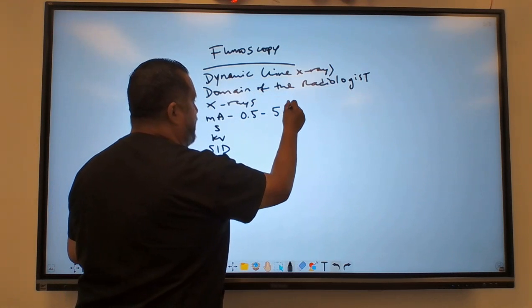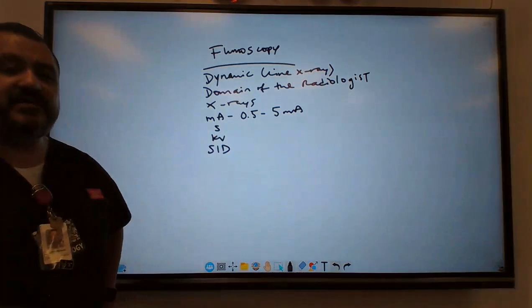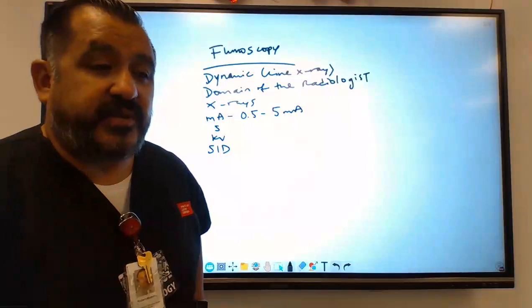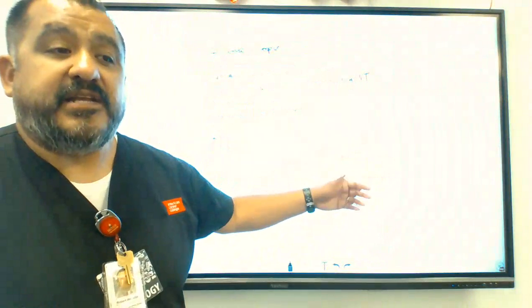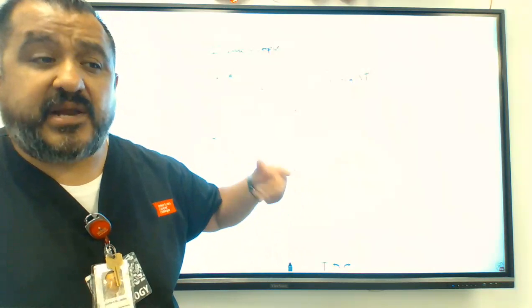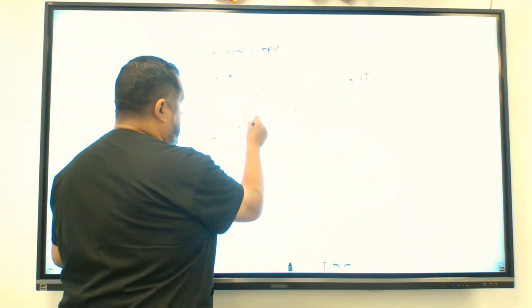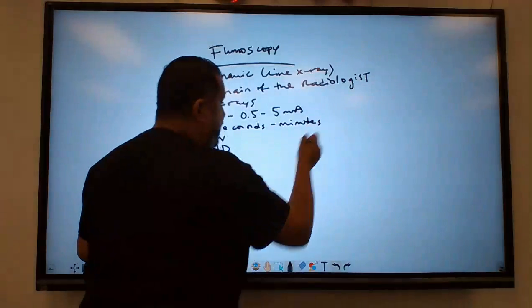0.5 to 5 mA. So how does that differ from diagnostic X-ray? Well, in diagnostic X-ray, we have anywhere between 25 mA all the way to 1,000 mA, and that's because there's no intensifier tube. And plus, we can let the time run longer. So in time here, you can actually have seconds. In fact, it can go to minutes of exposure.